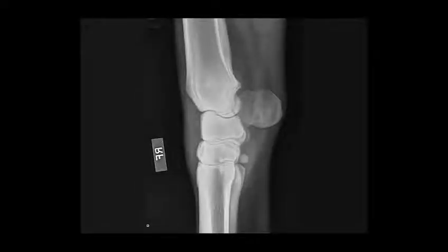Then, if we look at the radiograph that we obtain from this, we can see the dorsal and the palmar surfaces of the carpus. Because of the location of the accessory carpal bone, essentially sitting out here on the palmar surface, this is the one view where we can really see that accessory carpal bone not summated on other bones. I also want to point out that this horse that we use to obtain this radiograph actually has a first carpal bone here, which is not always present.